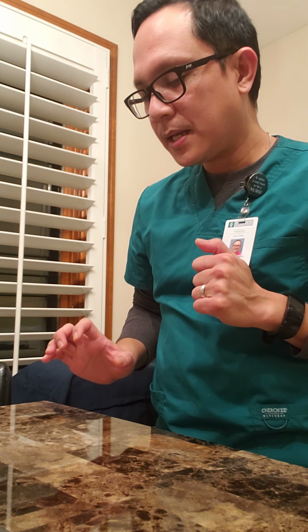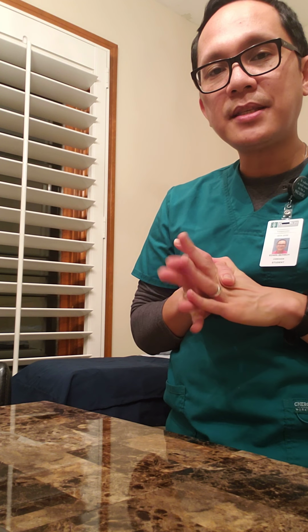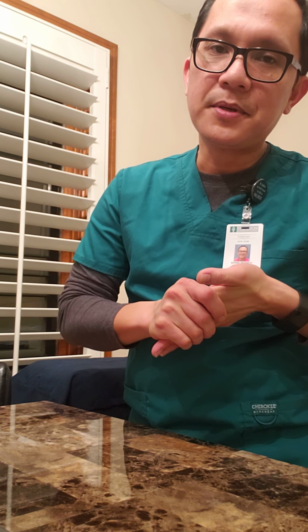You also want to make sure you document the condition of the insertion site, the condition of the dressing, especially the previous dressing. You also want to put in the dressing type that you applied, and of course how the patient tolerated the procedure.